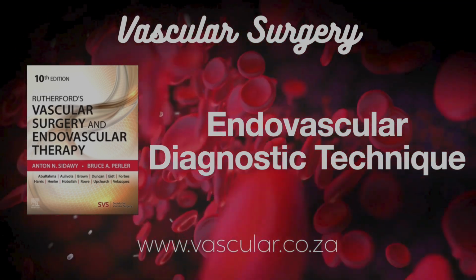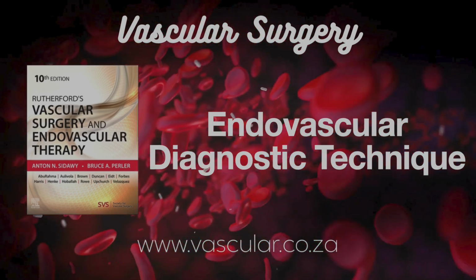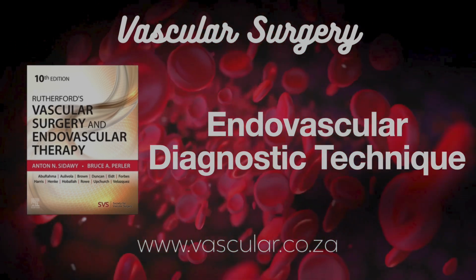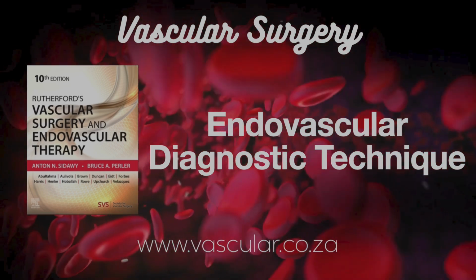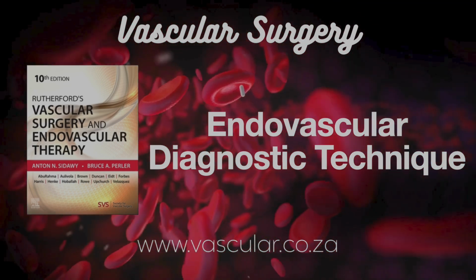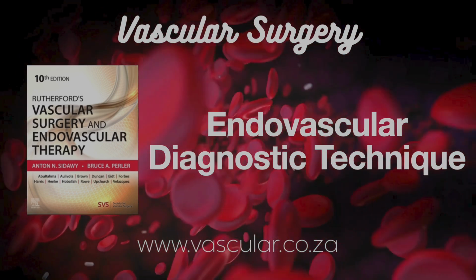And common uses for brachial access? You see a lot in cardiology for coronary work, setting up dialysis access, treating subclavian artery problems, sometimes for complex aortic aneurysm repairs, EVAR. And like I said, accessing mesenteric vessels often works better from the arm because of the downward angle they come off the aorta, avoids that sharp U-turn from the leg.